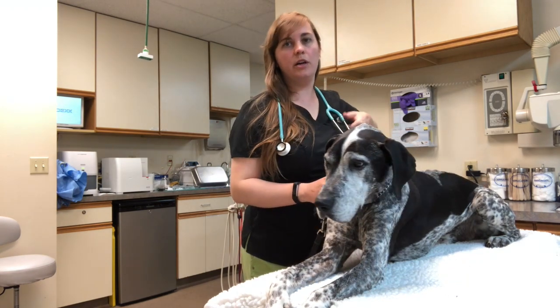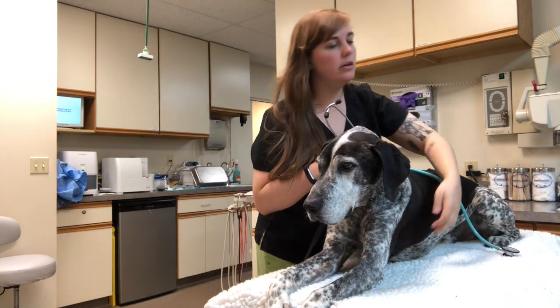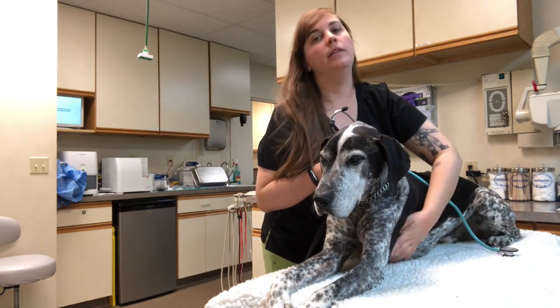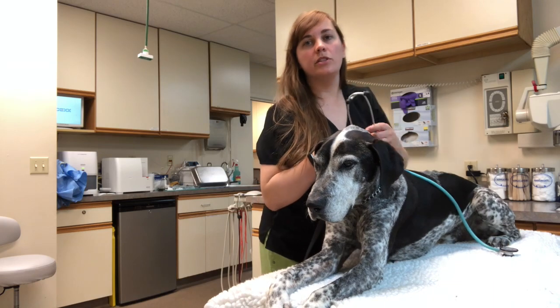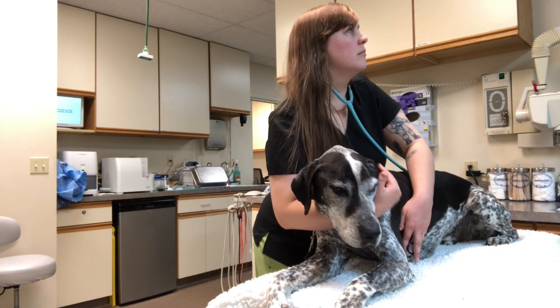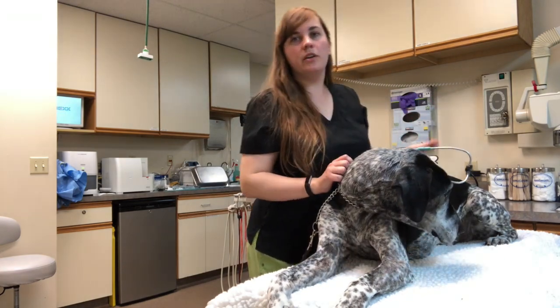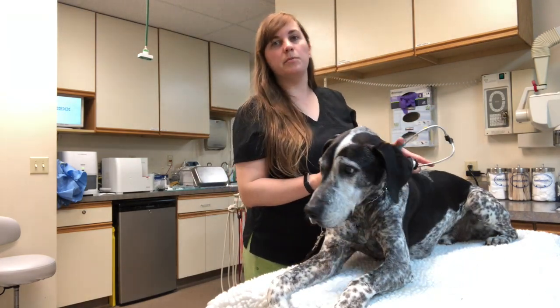So now I'm going to listen to his heart, and where I want to listen to his heart is just over the elbow on the left-hand side of his chest. So for Austin's heart rate, I'm getting about 80 beats per minute.